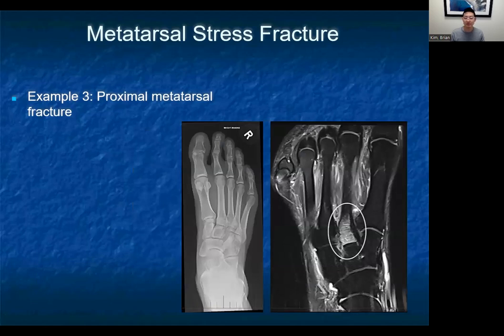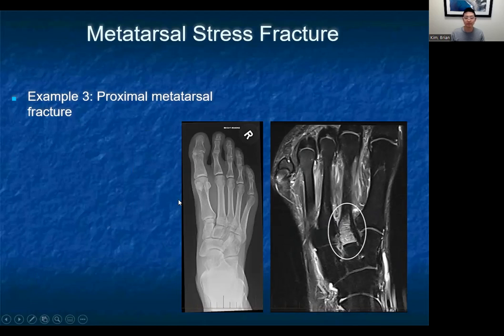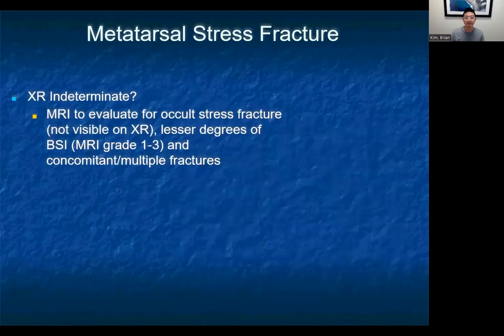One potential pitfall with metatarsal injuries is the proximal end of the metatarsal. As you can see on the x-ray, there's a lot of overlap and shadowing of bones in this region, which can make it very difficult to detect a fracture, especially subtle ones. An MRI was done and revealed significant bone marrow edema at the base of the metatarsal, consistent with a bone stress injury. If the x-ray is indeterminate, you can get an MRI to evaluate for occult stress fractures. In addition, MRI can also demonstrate multiple stress fractures even if radiographs may only indicate one.